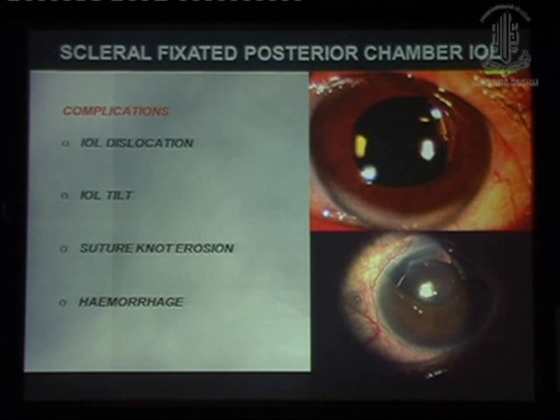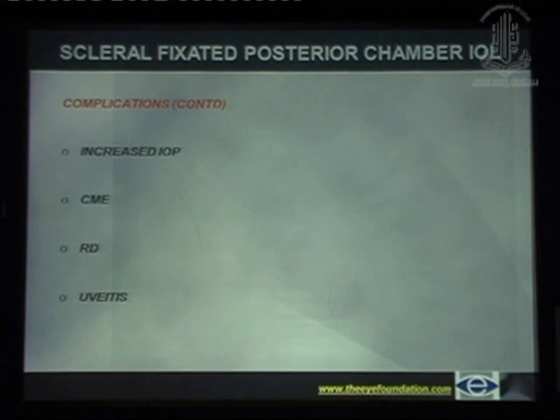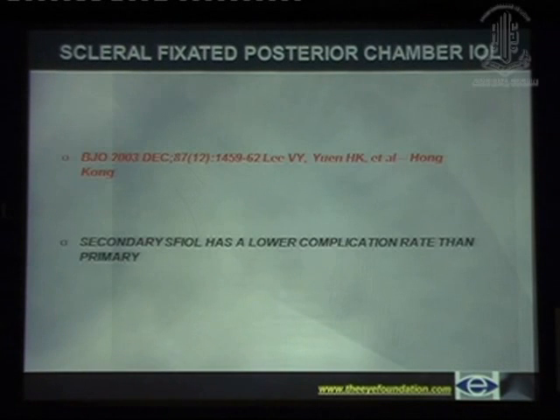There are various studies which have confirmed the efficacy of this procedure, and one study has proved that secondary SFIOL has a lower complication rate compared to primary, and SFIOL is a safe procedure with a small risk of significant complications. Before I conclude, I would like to give some practical tips which can improve the outcome.